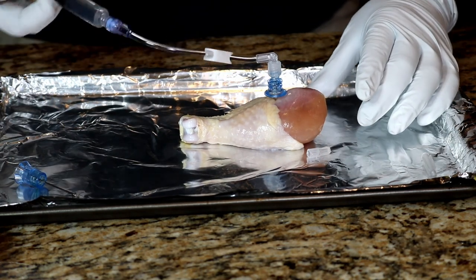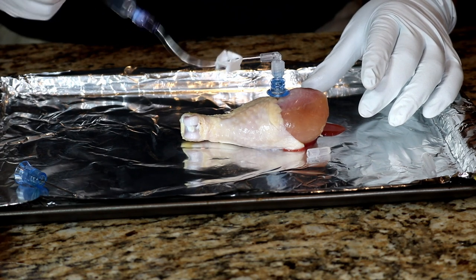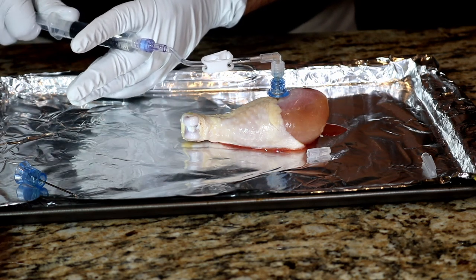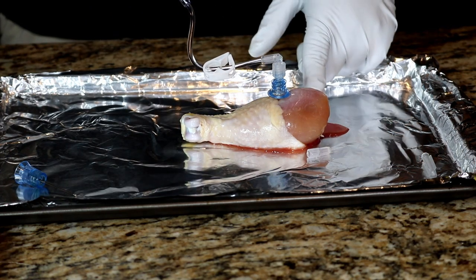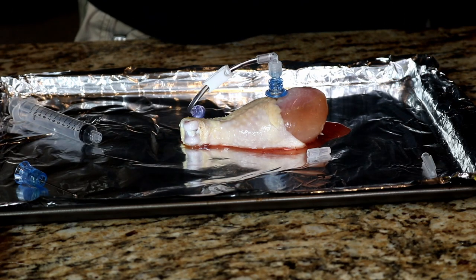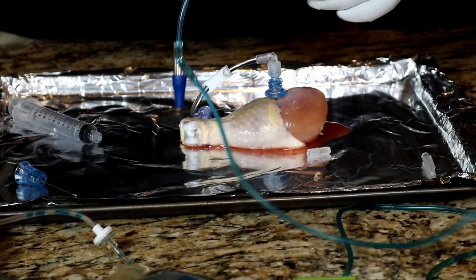We'll take the driver off and go ahead and push the flush. Yeah, we're in — I can already see fluid starting to come through. Let me see if I can draw back on it a little bit. When you do this you draw back until you see marrow. You can't see it on camera but this is turning pink, probably because I've already flushed a lot of the marrow through it.